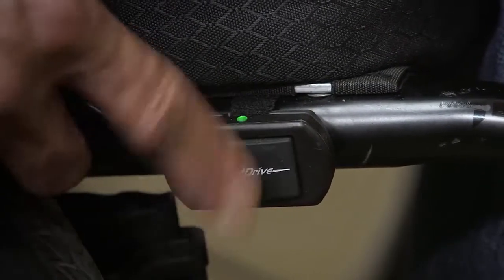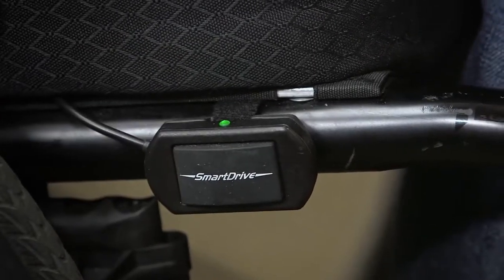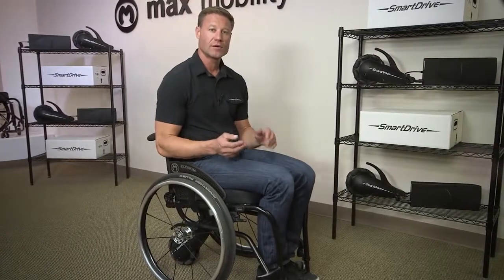When you change to outdoor mode, the light will blink and you will hear a long single beep. To change back to indoor mode, just press and release the button. You'll hear a short single beep and the light will go solid. You can freely alternate between indoor and outdoor modes by repeatedly pressing the button. You need to be comfortable changing modes and checking what mode you're in regularly so that you're prepared to safely use the SmartDrive in whatever environment you're in.